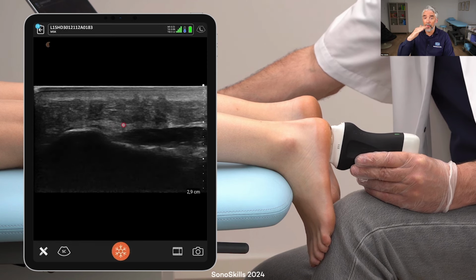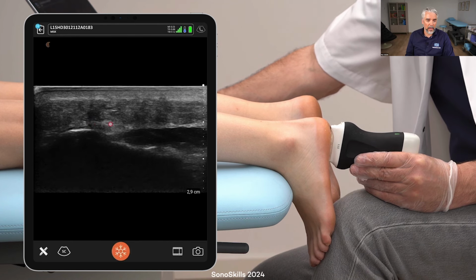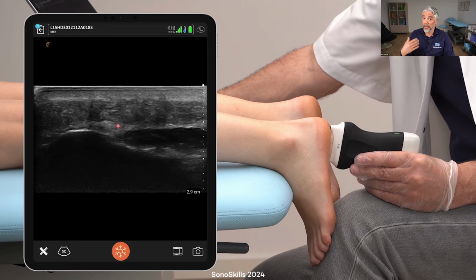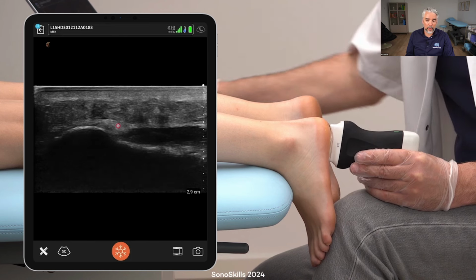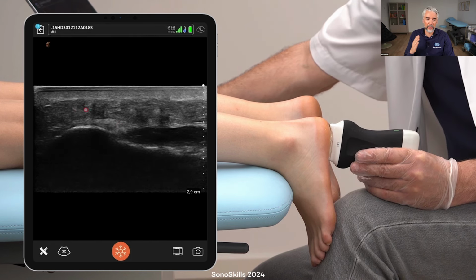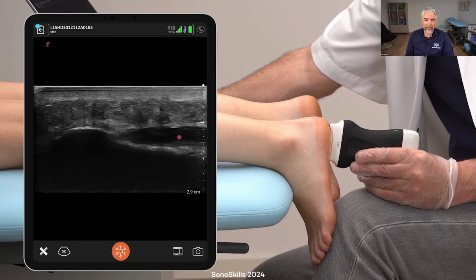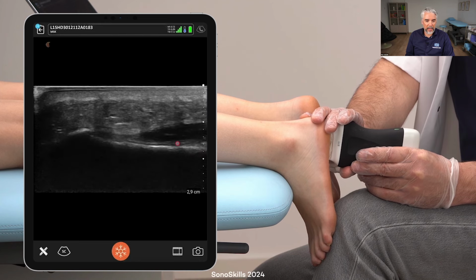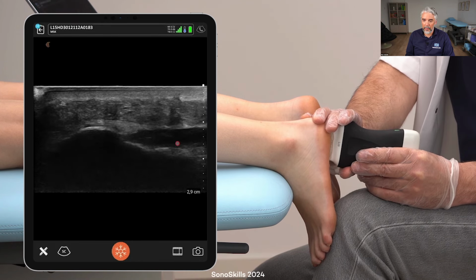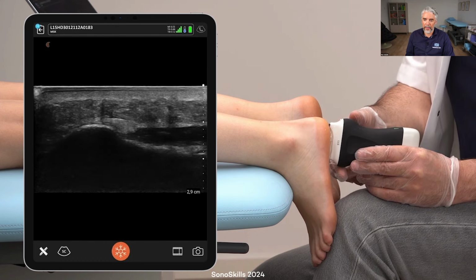And we're going to observe how thick the plantar fascia is over all its stretch. The plantar fascia should be hyperechoic. If it's dark, that could be due to swelling. We're going to slide the transducer from medial to lateral to see every fiber. On top of it, we can see the heel fat pad and also the skin, and underneath, like mentioned, the flexor muscle.